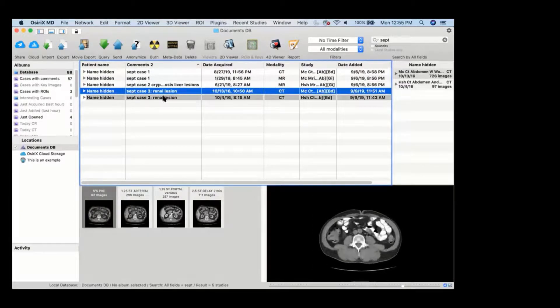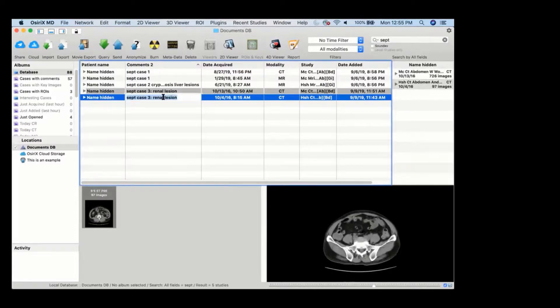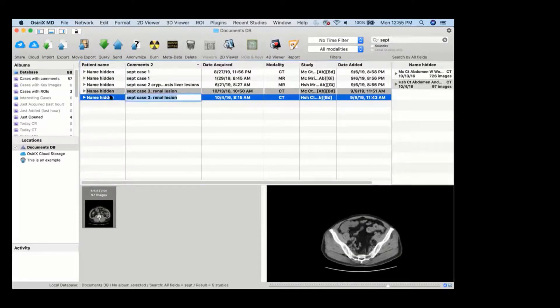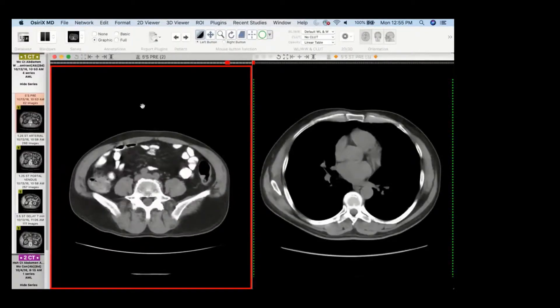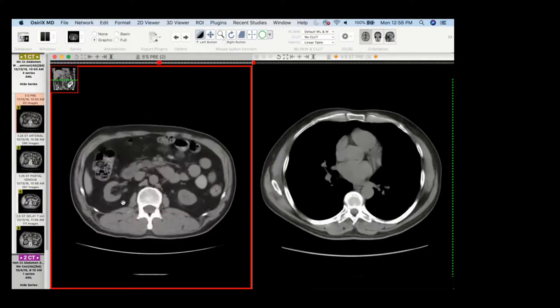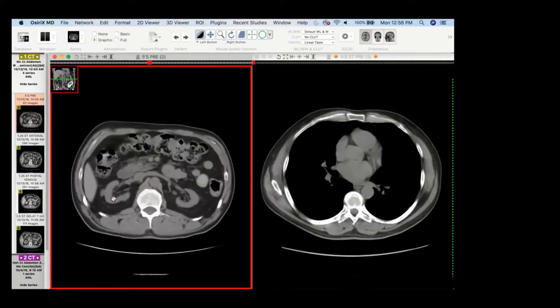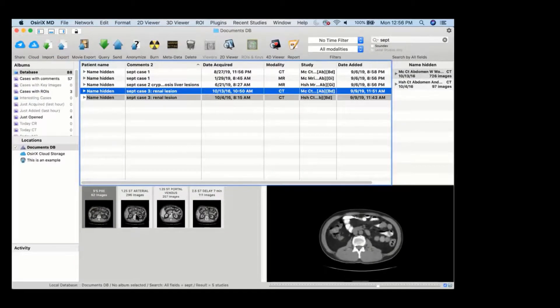This was a lesion that was picked up by my colleague on a non-con CT. There was this little lesion in the right midpole, and so he recommended a renal protocol CT, which the patient went on to get.